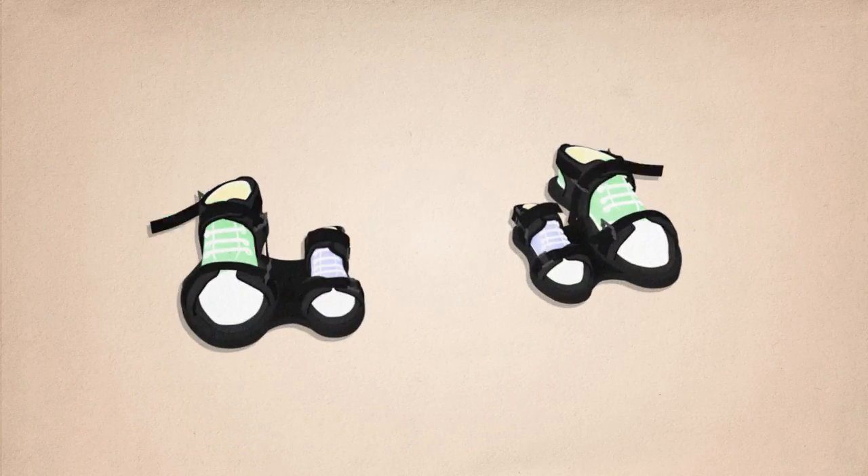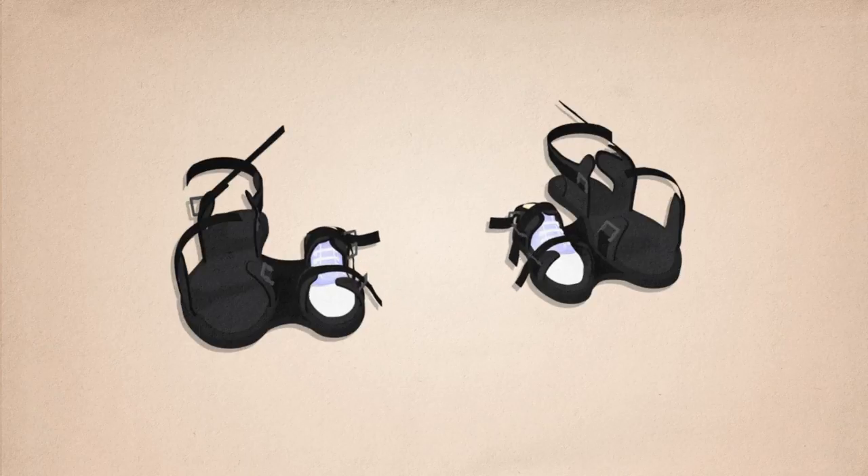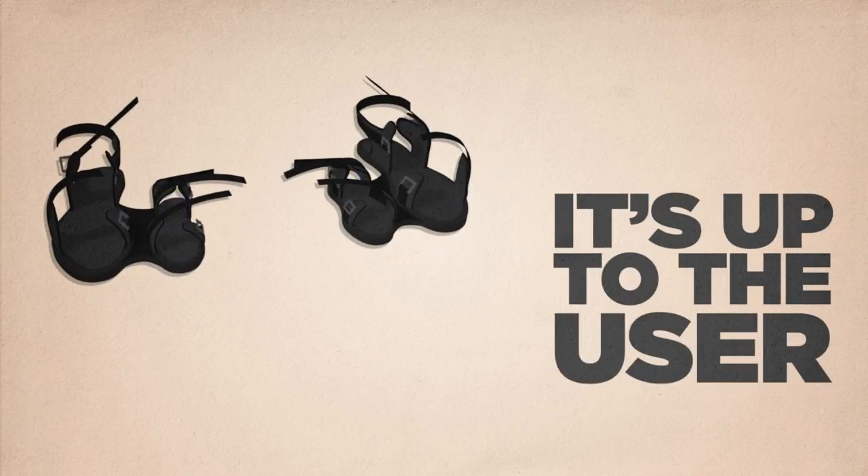Undo your feet from the double sandals, then your child's feet. You may take your child's feet out first if this feels easier for you.